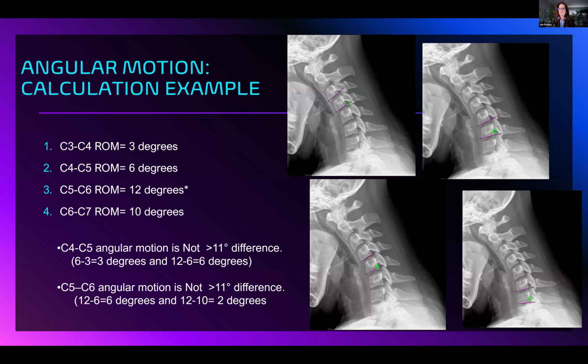In the impressions, it just states it. In my impressions in my report, it'll just say instability at C3. And then you can see above the description and how we got there and the terminology, and if there's anything else going on in that area. But the impressions is like a summation of everything. It's just a generalized comment of a diagnosis of what's going on. If you need the detail, then you have to look into the report, of course.